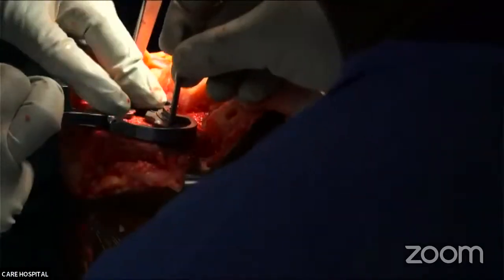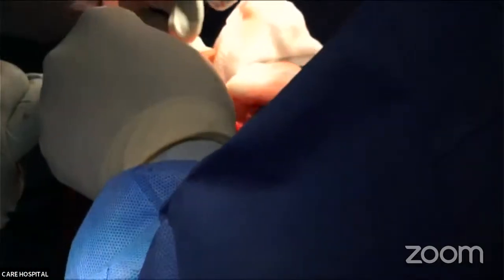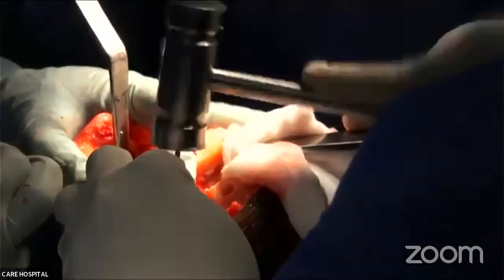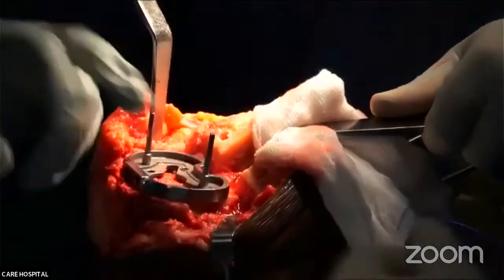We will do a bit of reduction osteotomy and the remaining will manage with screws. Yes, cement and screw. Space. Put it here. Yes. And one more here. Okay.